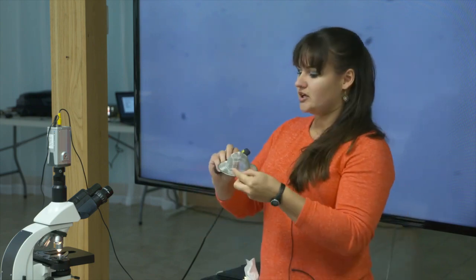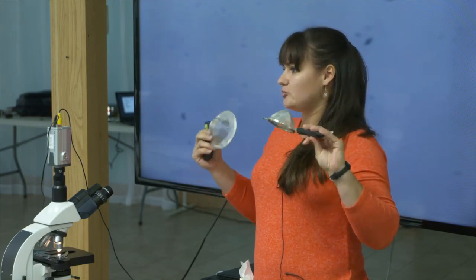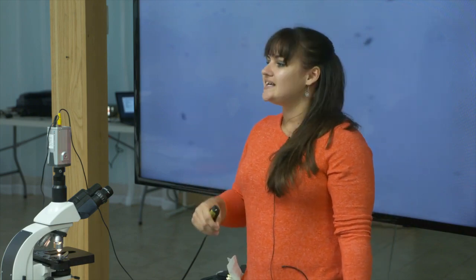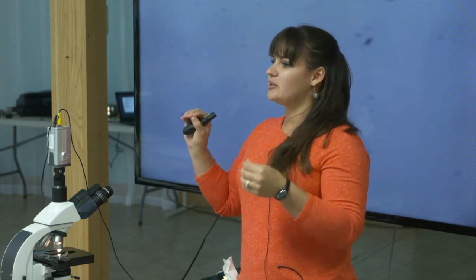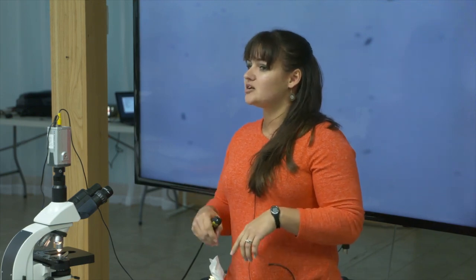The strainers can be a bit of an aggravation. As long as it's a fine mesh strainer — whether it fits your sink, whether it's a tea strainer — it doesn't matter as long as the mesh is fine enough. What this does is take the heavier material — the browse they've eaten, the fibrous material that went through the animal — and drain it out of the liquid, letting the true liquid and the parasite eggs go straight through. Some people use cheesecloth in several fine layers, but if you don't clean it well enough, eggs may stick to the fibers and give you false readings.